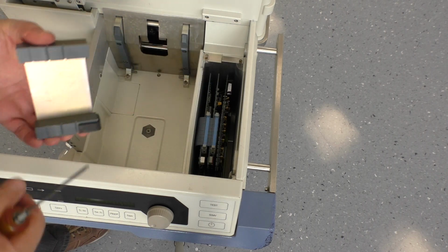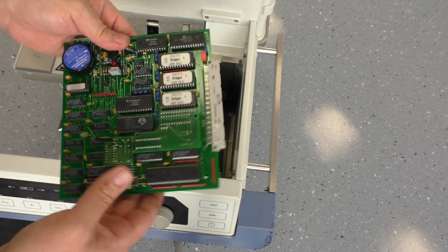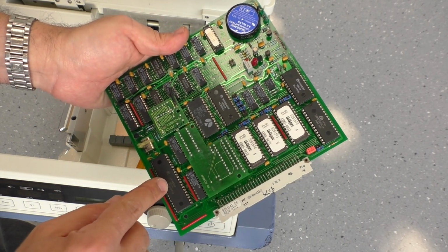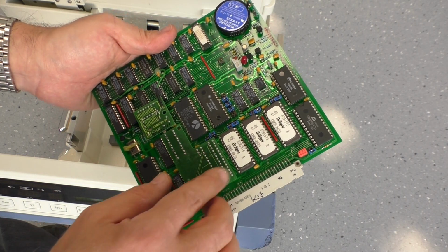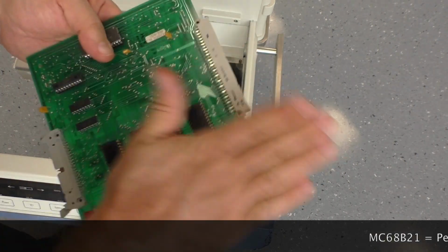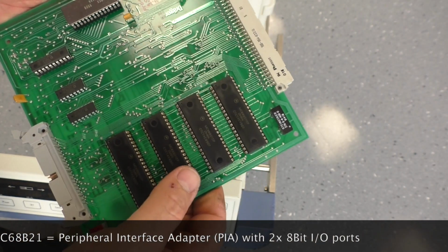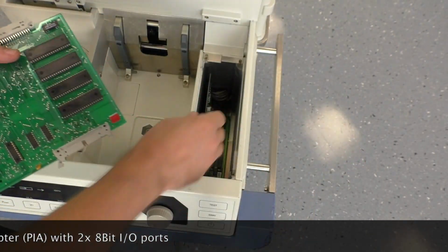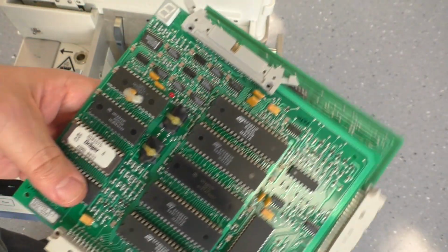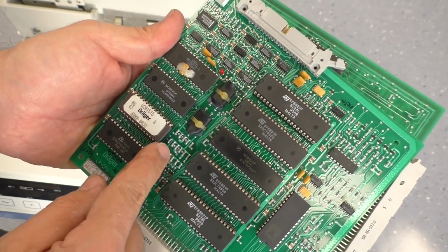Here we have some pieces of electronics. Let's see how that looks. Comes off very easy. Looks like a processor card. CPU MC6802. Some RAMs. Some more stuff. 68B21, could be some I/O ports. And even more of such stuff, more EPROMs.